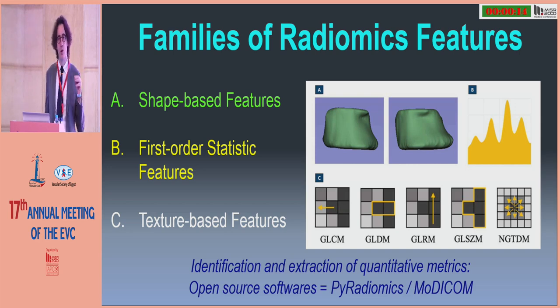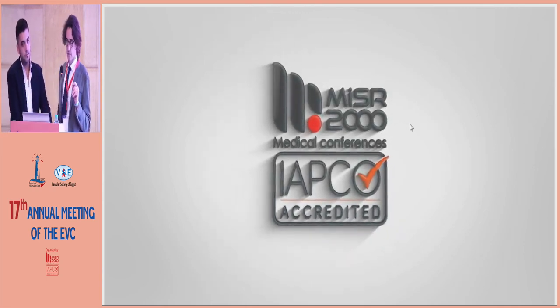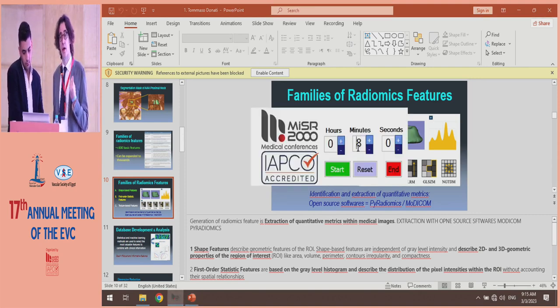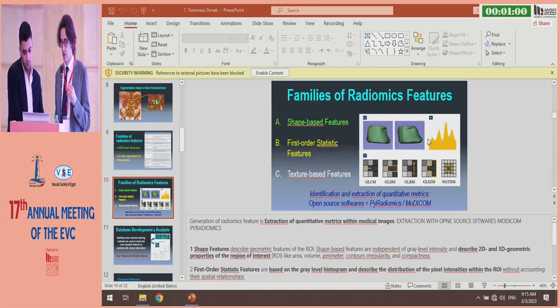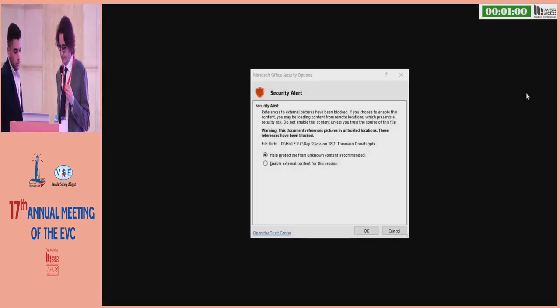But through radiomics, what we're asking the machine is not to recognize an endoleak or to tell us whether there is contrast or not. We are going to look into patterns of grayscale that are invisible to the human eye. So this is going to change completely the way we are going to use and look at any sort of imaging that we are familiar with.